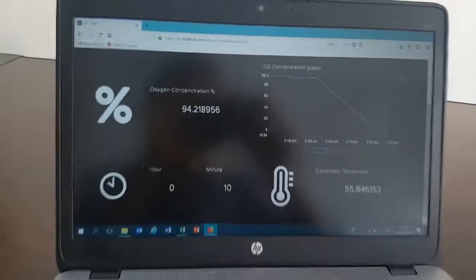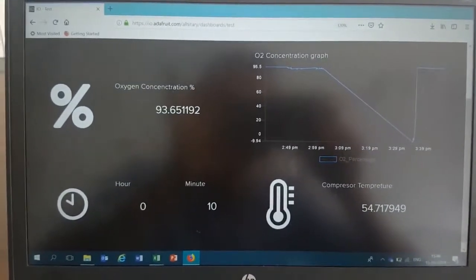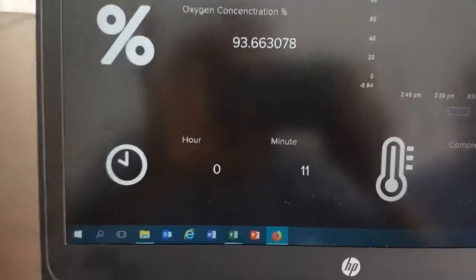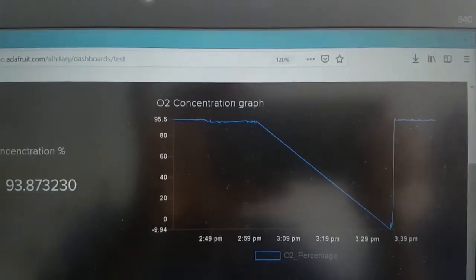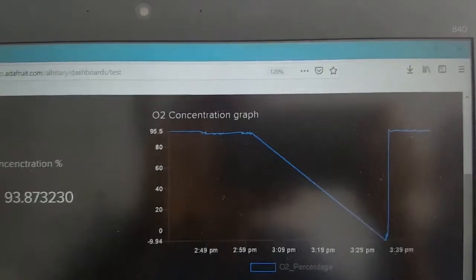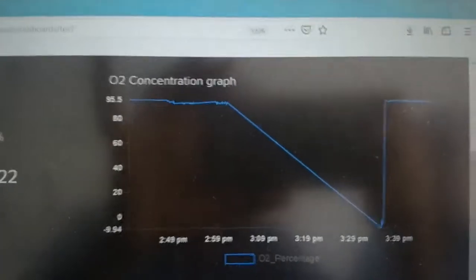This is now the dashboard. The values are being updated in real-time through Wi-Fi. We have the oxygen concentration, the hour counter, and the compressor temperature. We also have a graph showing the oxygen concentration over time. You can notice the graph going down when we turn the device on and off, and going back to stable.